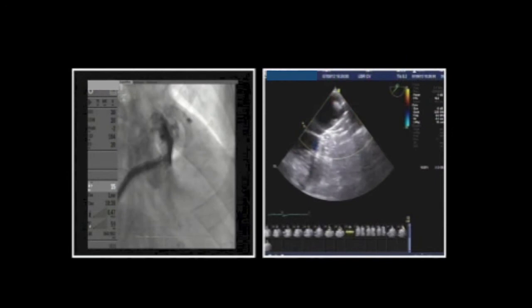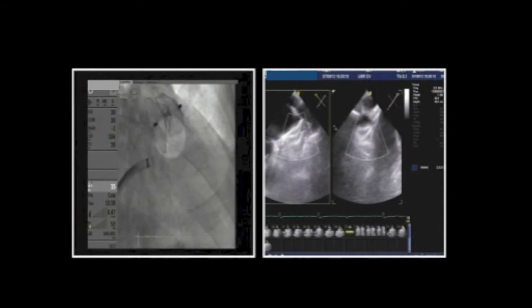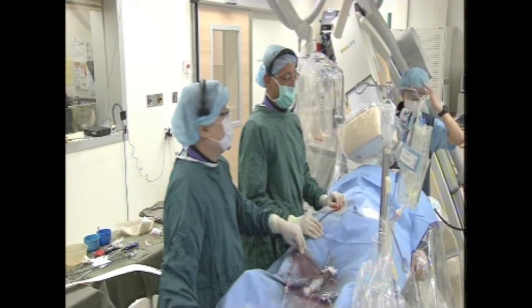After device release, normally I would remove the sheath, but in this case I will keep the sheath in the left atrium for a few minutes. This is a lesson from Professor Park — if you have any worries, keep the sheath for 5-10 minutes. If it's okay, that's fine; otherwise you can simply snare the device and retrieve it. Let's proceed to the last case.